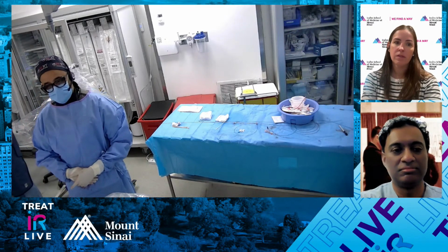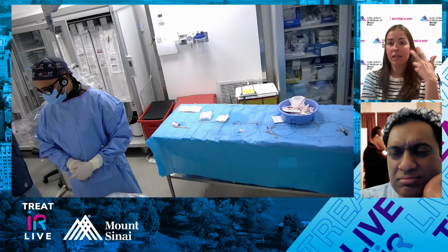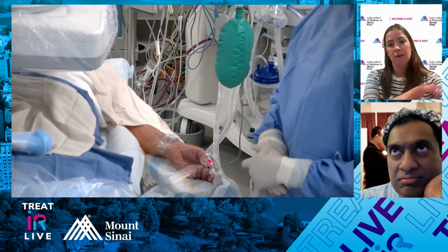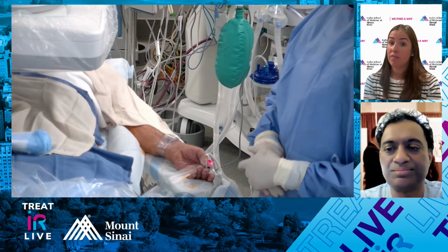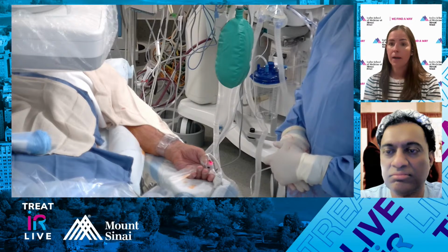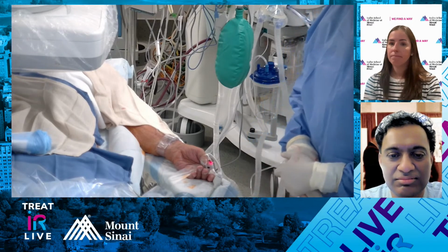We haven't used it a lot, so we didn't find it super helpful. A case that comes to mind is a patient who has a tumor and can't really rotate their arm, and I want to go ipsilateral. That's when I've used it. And there are specific closure bands for that. You do have to use a different one. You can't use a TR band for that. You have to use something else.